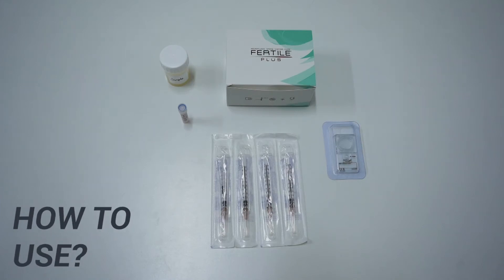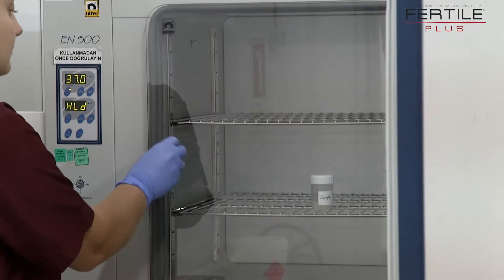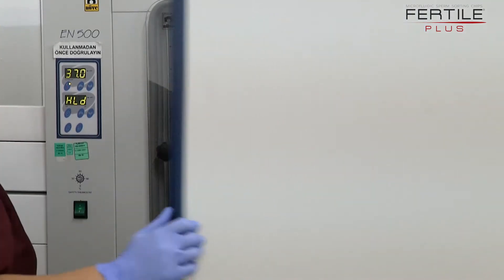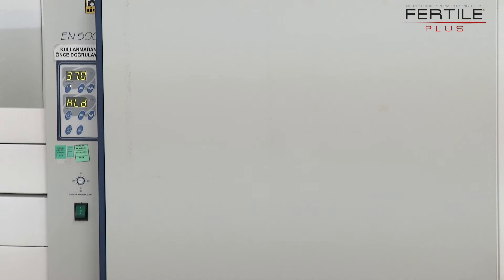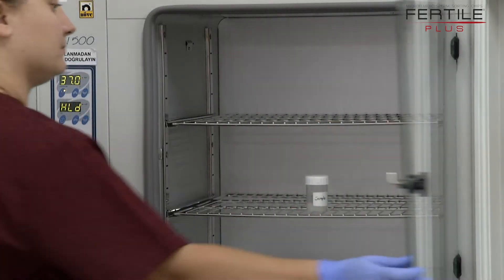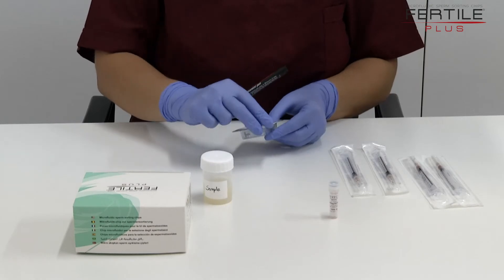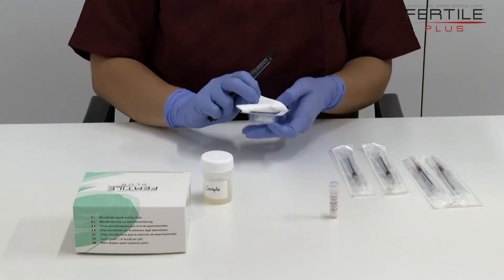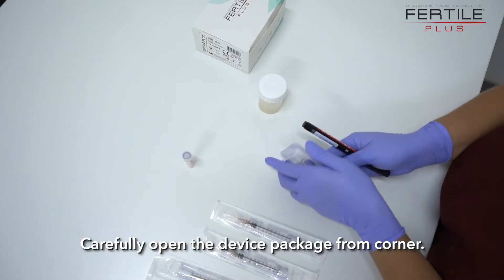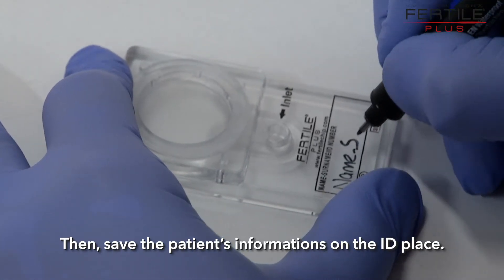Fertile Plus. Incubate the semen sample for 15 minutes to allow for liquefaction. Carefully open the device package from the corner. Record the patient's information on the ID label.